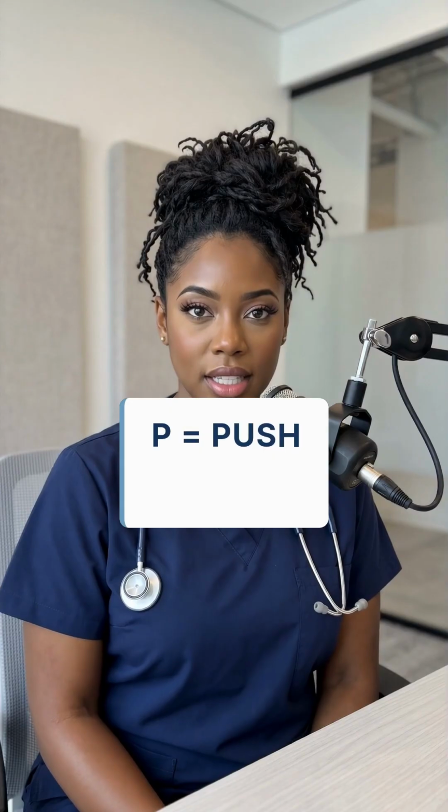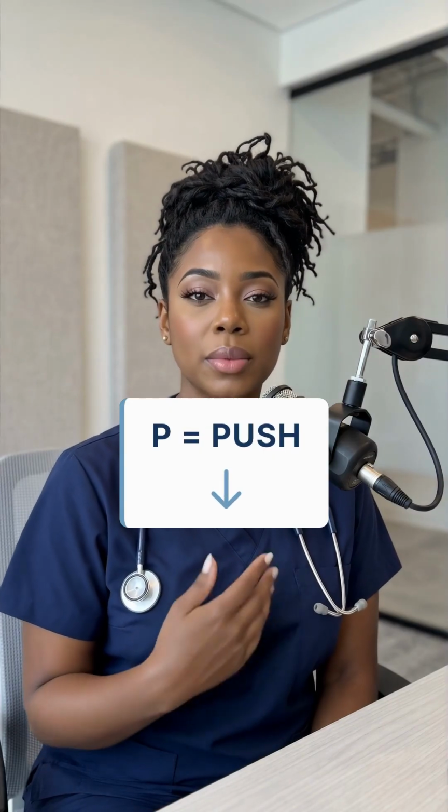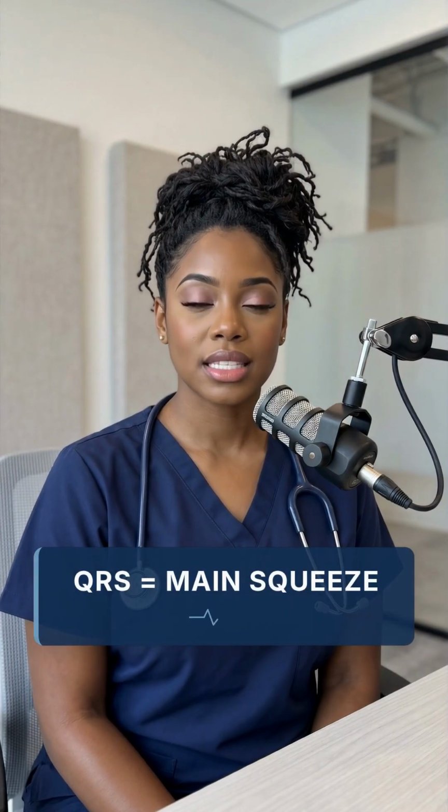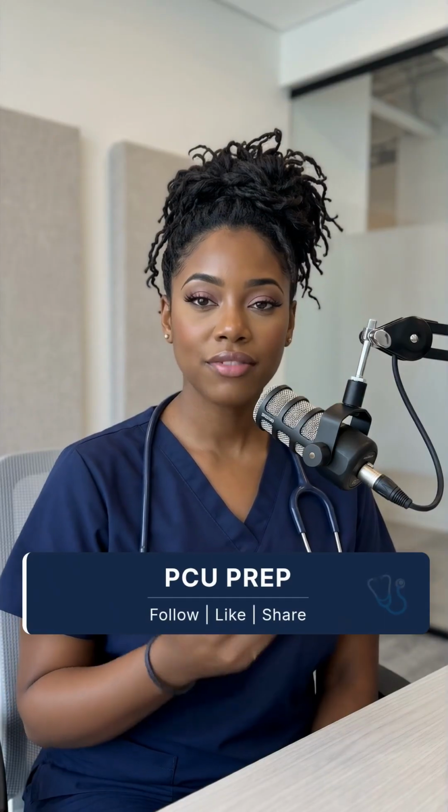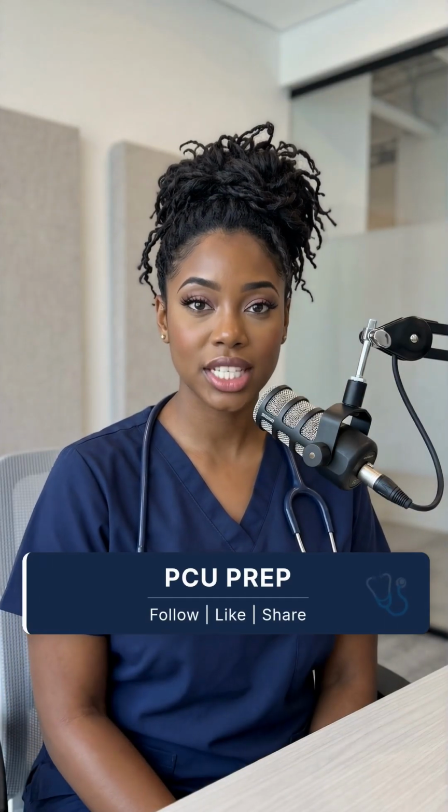Think of it like this. P equals the initial push from the atria. Think of the QRS as the main squeeze and the T wave as the heart's reset phase. If you understand that foundation, everything else in cardiology becomes much easier.